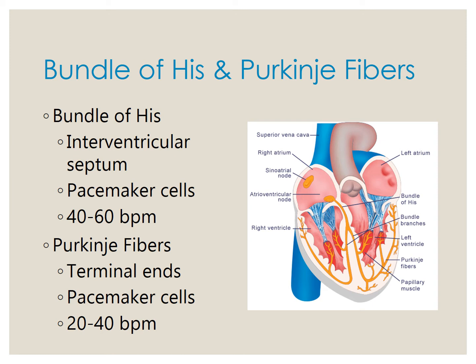Okay, for most of us, 20 to 40 beats per minute is very bradycardic. It's very slow, so your patients will probably be symptomatic at this point. This is where we get to look into some different types of blocks, especially that third degree block that I'll talk about a little bit later.